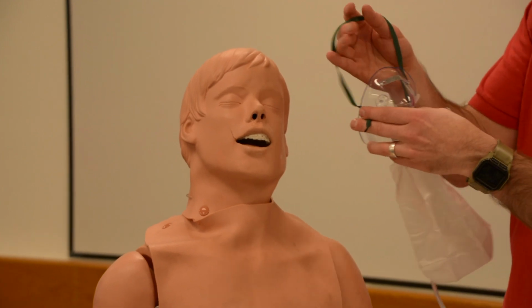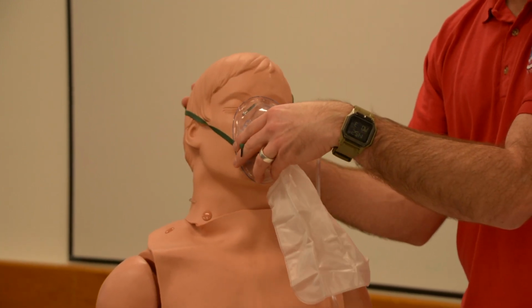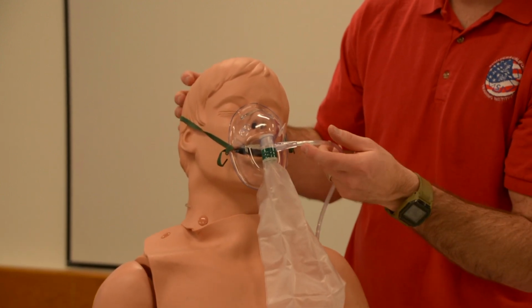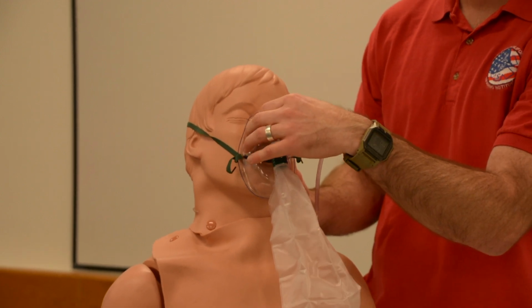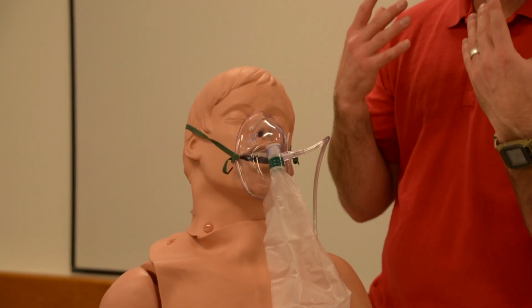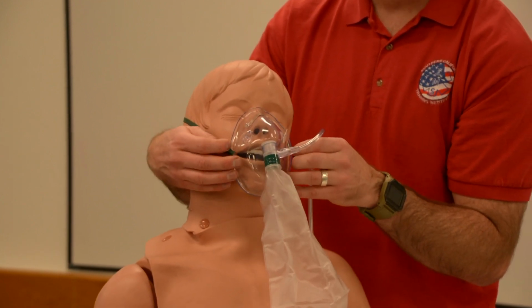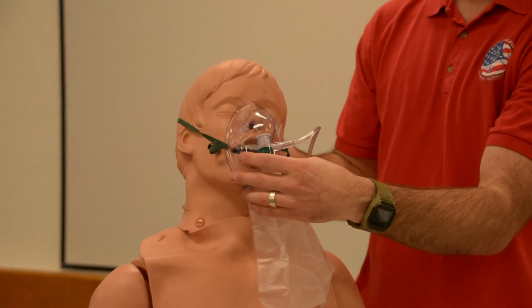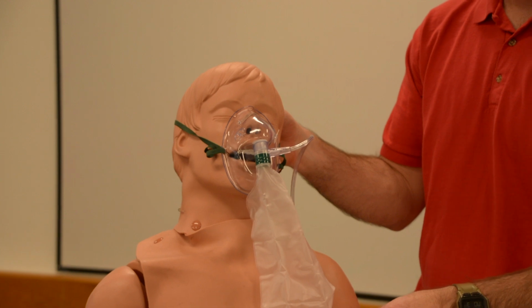The little green strap should go all the way behind your patient's head. All right, and the mask should just go right on their face. Now, a couple things we can do to make sure this is fitting appropriately: it's got a little metal bar here. Just bend that over your patient's face. It helps get a nice seal around your patient's nose. And then we've got these two little green tabs on either side. We just give it a little pull to make sure that's nice and snug on your patient's face, and we're delivering the right amount of oxygen here.